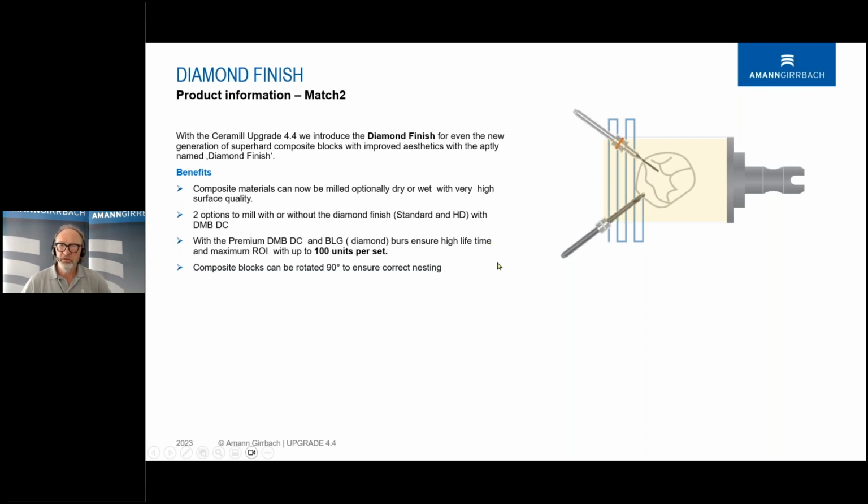So what does it mean? First, we are using burrs, the diamond coated burrs, and later on we are using our new diamonds, not the old ones. These are now called differently. I will explain it to you later on.